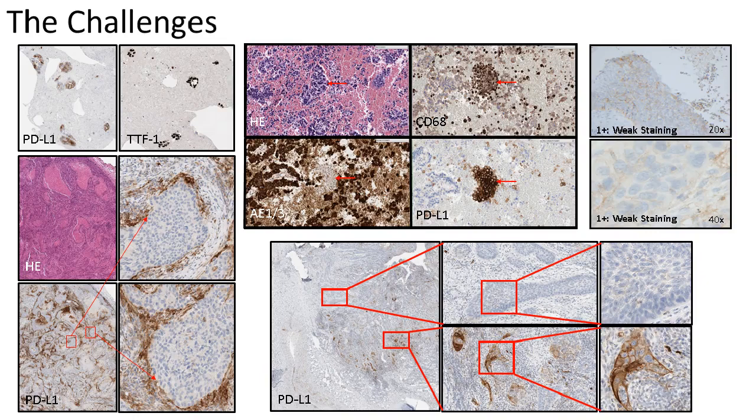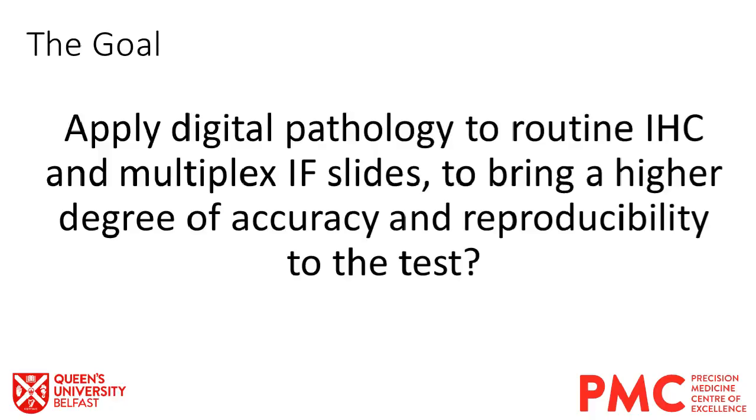As well, the heterogeneity of PD-L1 is an issue. When you're looking at a large resection which contains hundreds of thousands of cells and tens of thousands of tumour cells, these small foci of PD-L1 positive cells across the section need to be counted up, and it can be extremely difficult to determine whether or not all these cells together make up at least 1% of the specimen. This is something that digital pathology can help with massively.